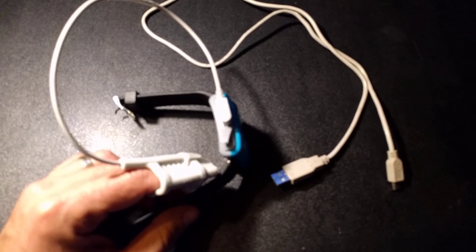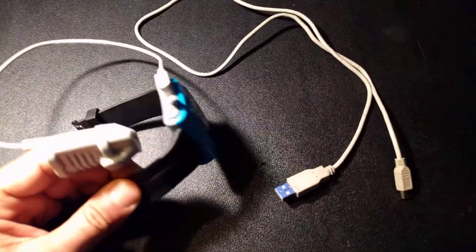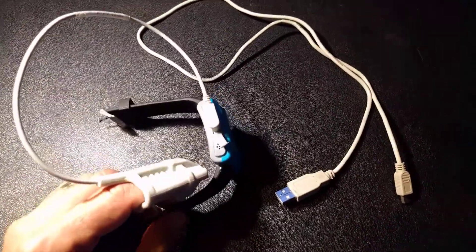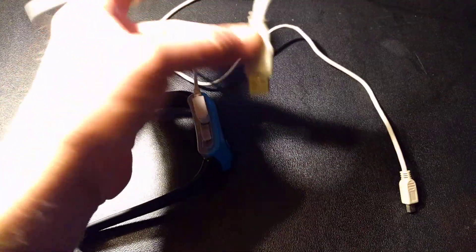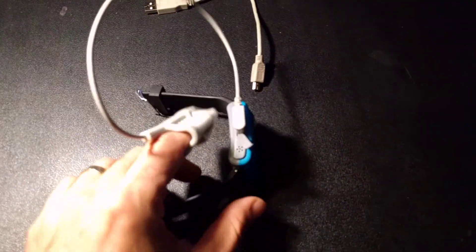The USB cable is just for charging in case the battery gets low. You attach it here — just pull off the probe and put it in the USB slot — and then you can charge it on anything where you can plug in USB power. Let me put the cable over here. Let's just deal with the probe and the oximeter.